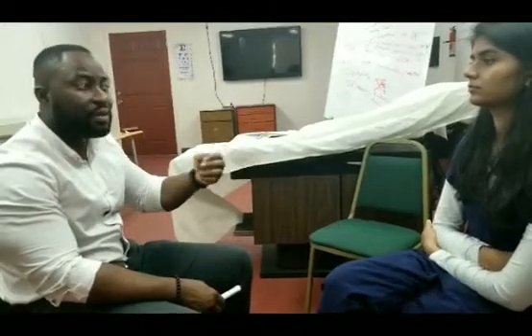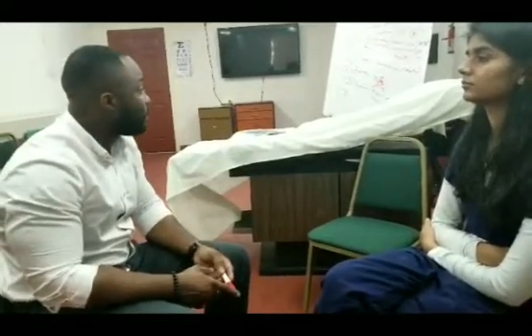As you can see in diabetic retinopathy, and that is differentiated from other kinds of retinopathy like hypertensive retinopathy. I would also be looking for soft exudates, also known as cotton wool spots, which represent dead necrotic nerve fibers. I'm looking for hard exudates, which represent leakage of lipids from a ruptured blood vessel. And I also want to be looking for swelling of the macula, macular swelling as well.